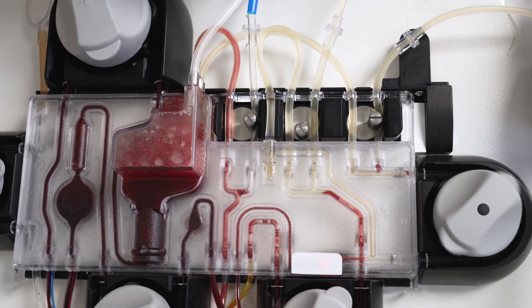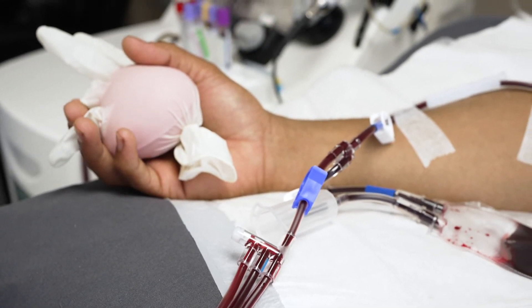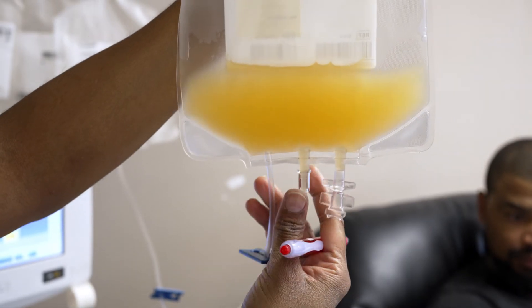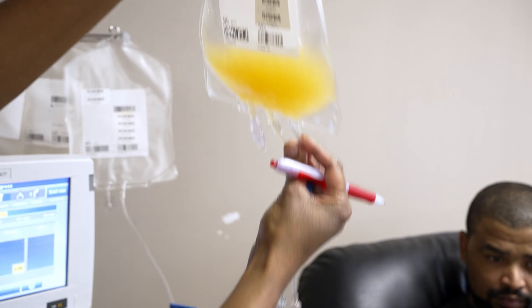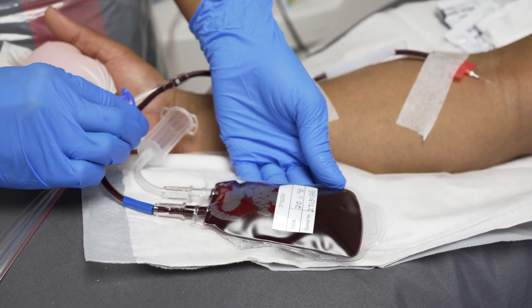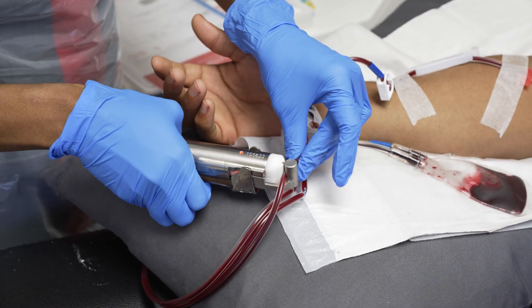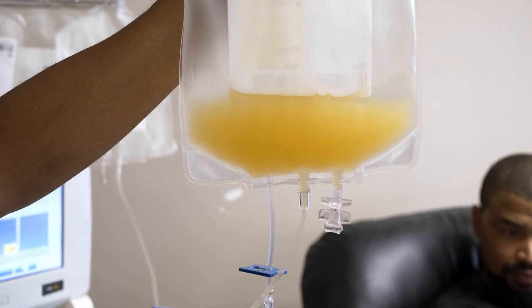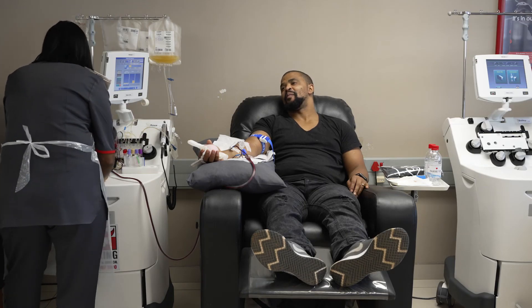Using leukophoresis also allows the scientists to collect a smaller volume of blood, since most of the blood that flows through the machine is returned to the donor. A small 50ml sample containing concentrated white blood cells like this contains the same number of white blood cells that you would find in 2 litres of blood. This allows the donor to provide samples more frequently without affecting their red blood cell levels. The white cells collected are quickly replaced by your body without causing any harm to you.